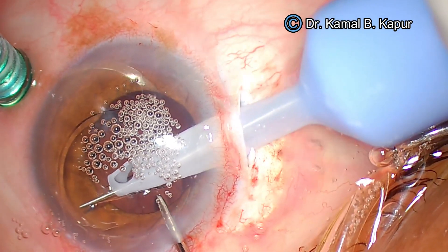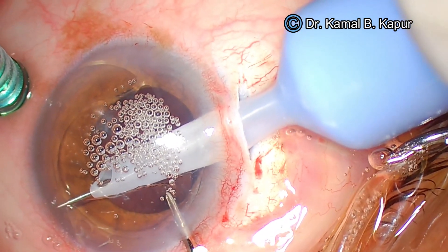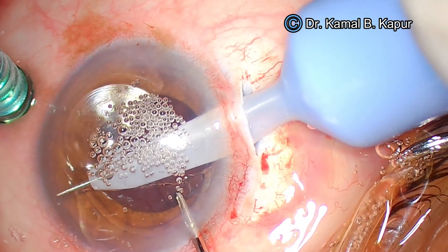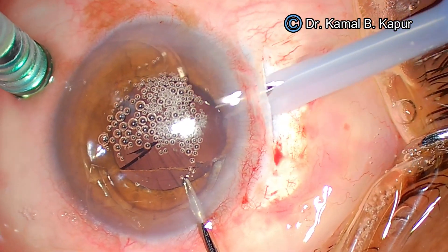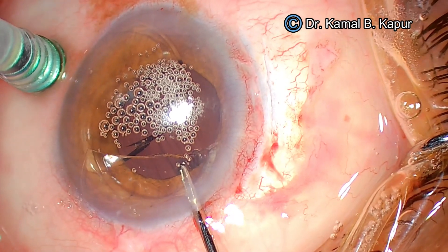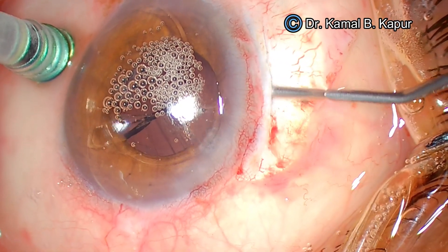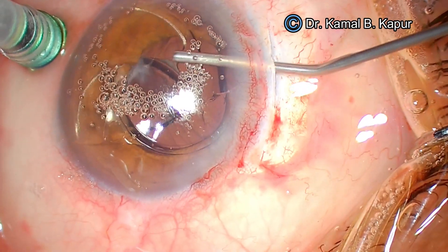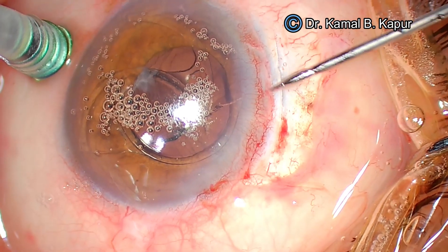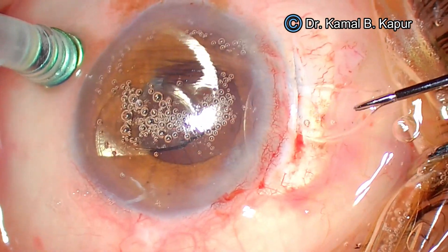It's a dual movement: partly the cutter moves forward into the IOL, and the left hand pulls the IOL towards the cutter. This enables very controlled cutting. You will see the IOL has been cut into one-third and two-thirds pieces — the aim is to cut the IOL into three slivers. We coat the endothelium again. We must be very careful because the posterior capsule is open; we don't want sharp pieces of the IOL to drop down. So the first thing to do is pull out the smaller piece.